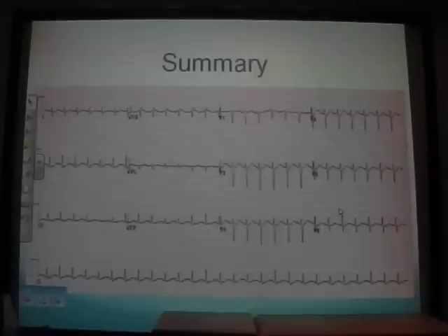So therefore, it's sinus rhythm. Sinus tachycardia in particular? Yeah, perfect. That's what you say. And then there's no axis deviation, and then I'd just be looking at each of the areas to look for any abnormalities. The T waves look normal. I can't see any QRS changes. I can't see any ST changes. So I think it's just sinus tachycardia. Just sinus tachycardia. Yeah, brilliant.